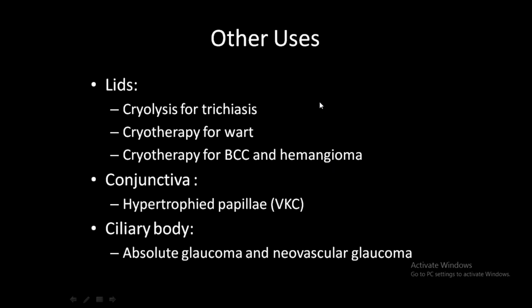What are the other uses? Other than the uses which I mentioned, cryotherapy can be used for trichiasis, warts, basal cell carcinoma or hemangioma. In the conjunctiva, if there are hypertrophied papillae, as in case of vernal keratoconjunctivitis, this cryotherapy can be applied. In the ciliary body, in cases where IOP is very high, like absolute glaucoma or neovascular glaucoma, you can use this cryo.